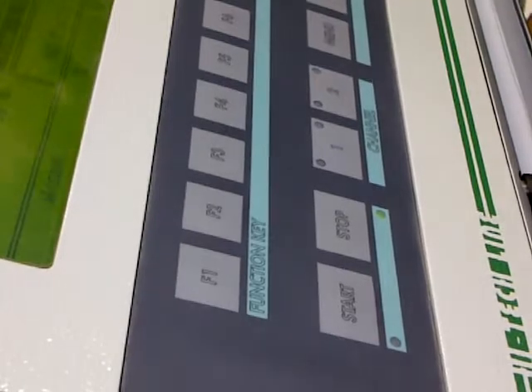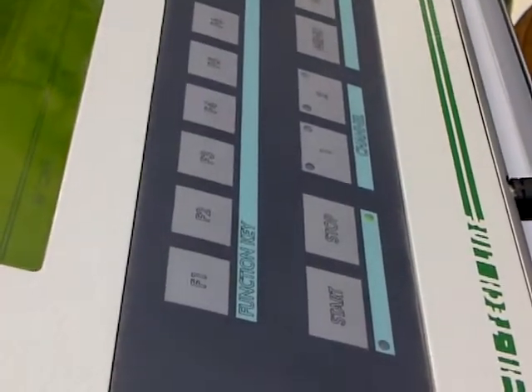If I start, no contact. What is the next? What is wrong? Why do I have to put it on the skin? The current is fast, so it's coming out. Don't say current, it's sound. Ultrasound. Because once you switch on, the ultrasound produced will come through this coaxial cable and come out.